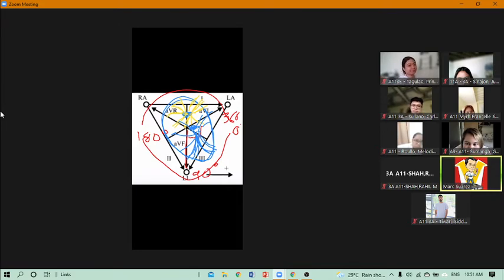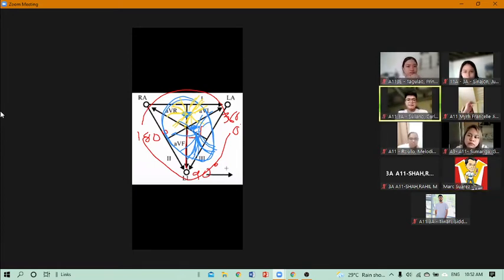So what the electrodes do, the things that are placed on the anterior thoracic cavity, they measure the generated impulse, right? They measure the generated potentials. Do you follow? Yes, Doc. Okay.